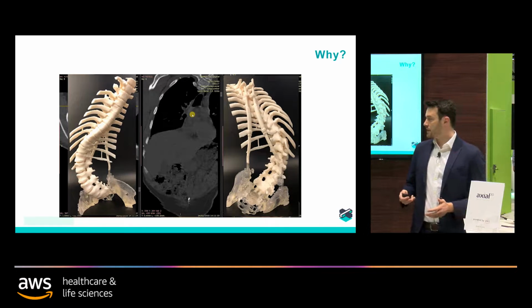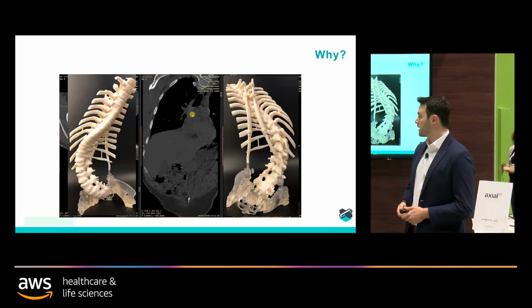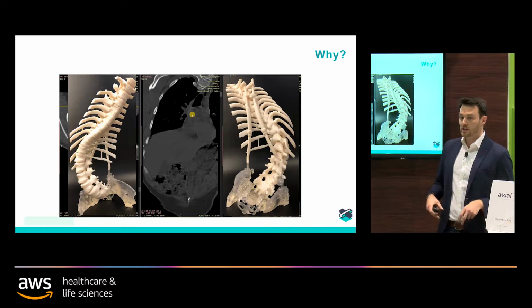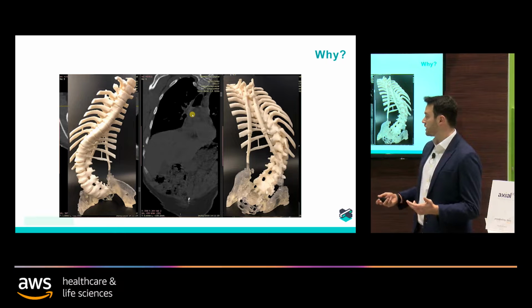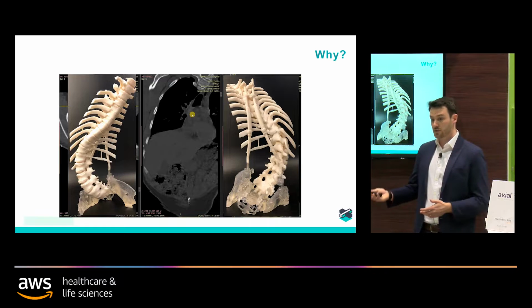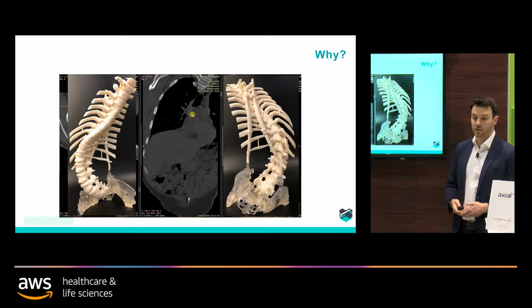One of the things that Mr. O'Brien was able to see that he wasn't able to find on the two-dimensional images were the rods that were anchoring on Jonah's pelvis. The rods here had actually fractured through the iliac crest. This meant that Jonah would have had to go in for an extra surgery because he would have found this out on the table. Because we were able to give Mr. O'Brien and Jonah this model, we were able to reduce 3 hours of surgery and also reduce the readmittance of Jonah into the Royal Victoria Hospital.